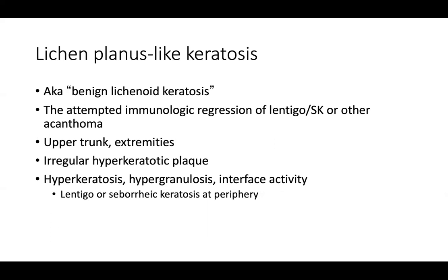You'll see hyperkeratosis, hypergranulosis, and interface activity. Again, you've got to look to the edges to see, do you find normal lentigo or normal seborrheic keratosis? So that way you will have more confidence. Okay, I'm dealing with that.